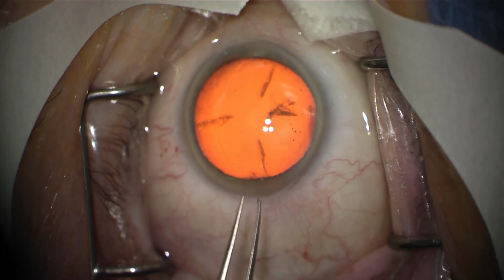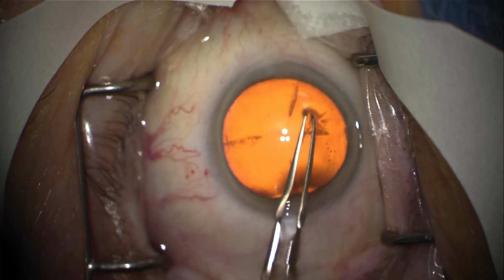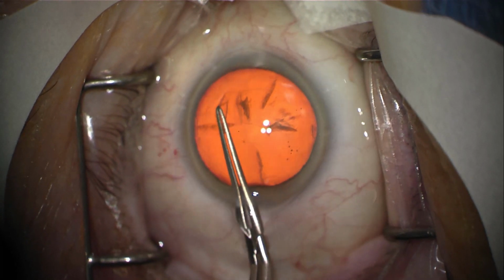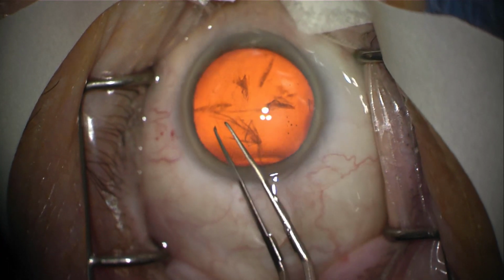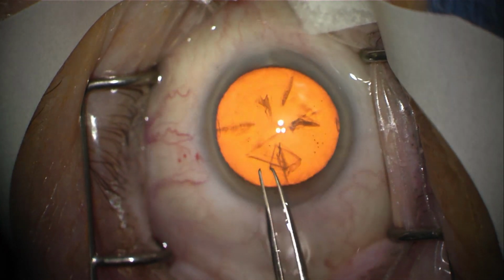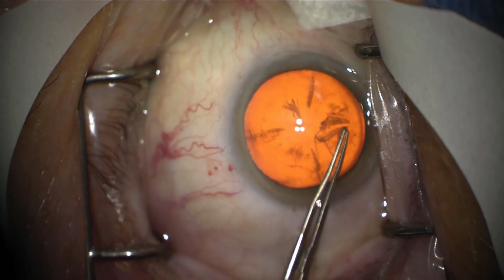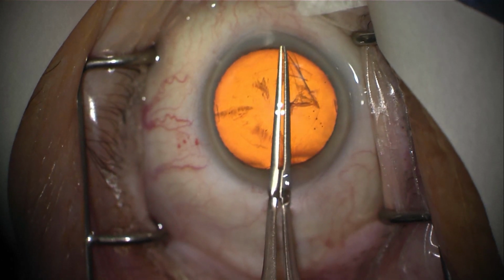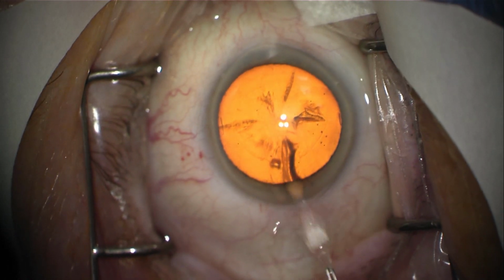What I do now, after making that initial incision in what's called the anterior capsule of the cataract, is I'm inserting a forceps. This is called a Utrata forceps, and as you can see, I'm actually tearing this capsule, the candy shell of the M&M, very carefully and trying to make a perfect circular tear. This is a very delicate procedure. This is probably the most critical part of cataract surgery. It has to be done perfectly. If it's not done perfectly, the rest of the procedure is often much more complicated. You can see I'm just about finished tearing the entire anterior capsule, and I'm going to remove it from the eye, and just to demonstrate, I put it on the surface of the cornea there.